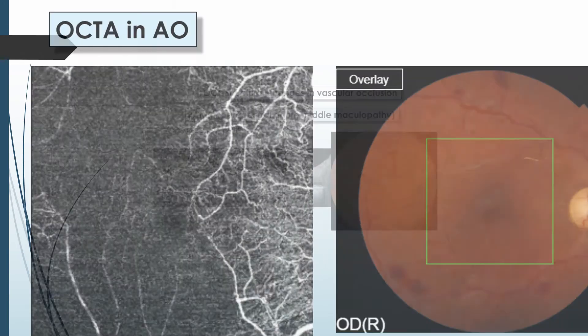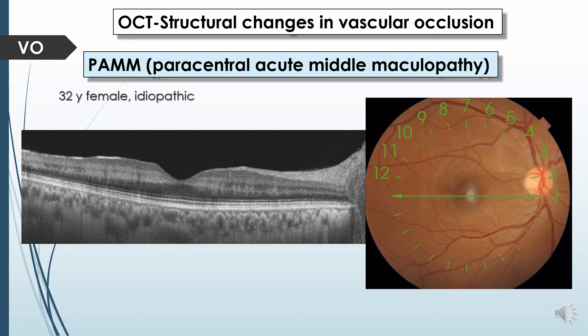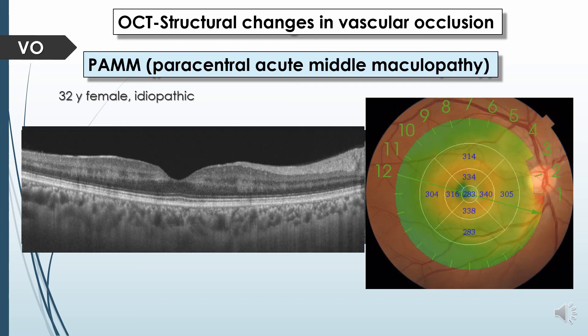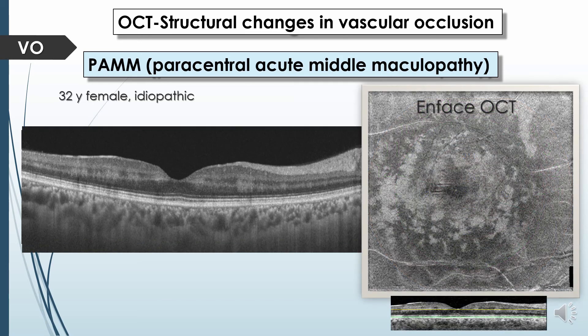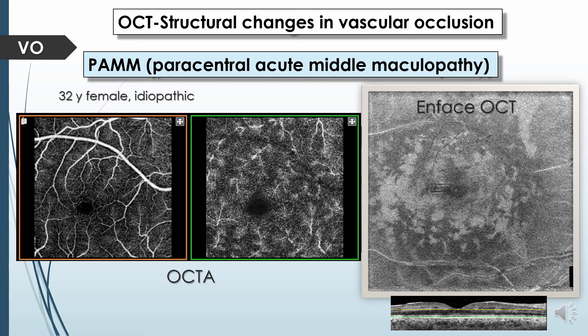OCT and OCT angiography play an important role in diagnosis of paracentral acute middle maculopathy (PAM), which may occur secondary to various retinal disorders like hypertension and vein occlusion, or may be idiopathic. In cases where color and fundus fluorescein angiography are equivocal, B-scan OCT shows characteristic hyperreflectivity of the middle retinal layer precisely at the junction between the inner nuclear and outer plexiform layer, which may be segmental or diffuse. En-face OCT through this layer shows hyperreflectivity surrounding the occluded vessels, while OCT angiography shows low or absent flow signals at the deep capillary plexus with loss of the characteristic appearance of this plexus.